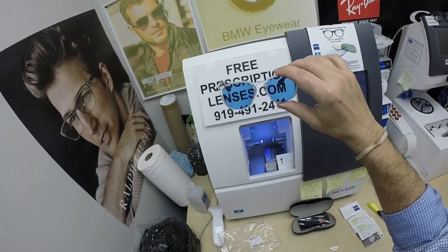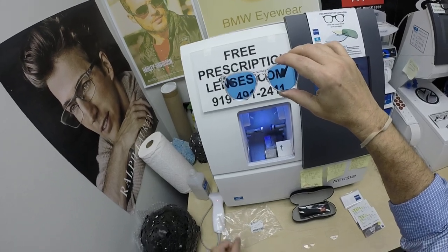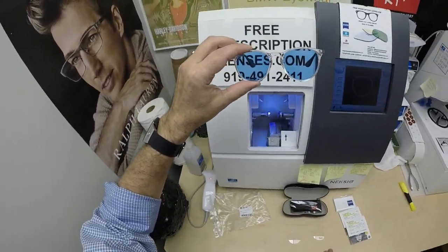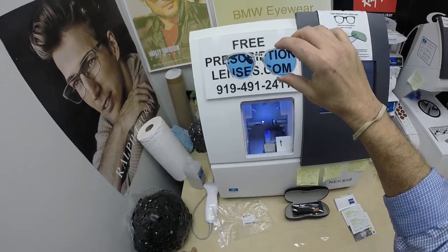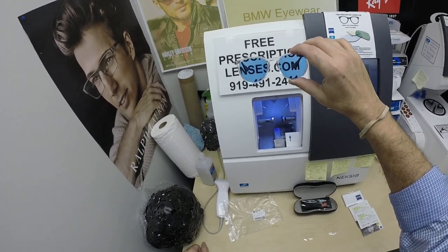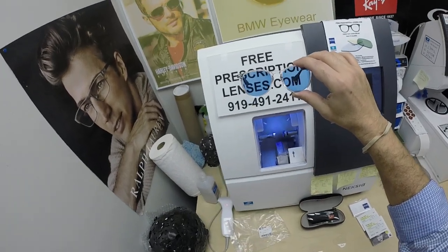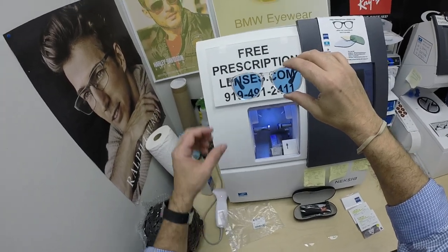Let me recap. In order to get this tint with DuraVision Platinum, I have to use at least CR-39 plastic or high index. I can do the DuraVision Silver anti-glare coating, which also has a bluish hue — a blue reflex in certain lighting at certain angles. DuraVision Platinum has the least amount of reflectivity of any of the anti-glare coatings. I know I can do DuraVision Silver for $79, and the Platinum is $99. DuraVision Silver at $79 can be applied to polycarbonate on a tinted lens — I just can't do the Platinum. Welcome to being inside my head.